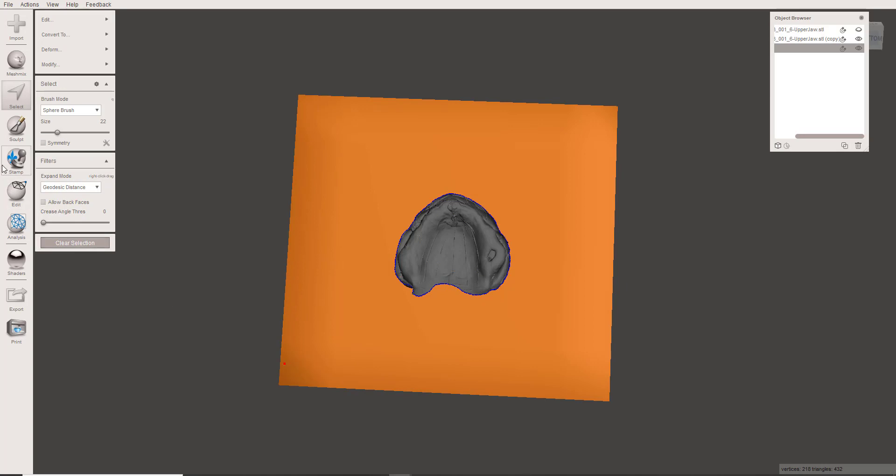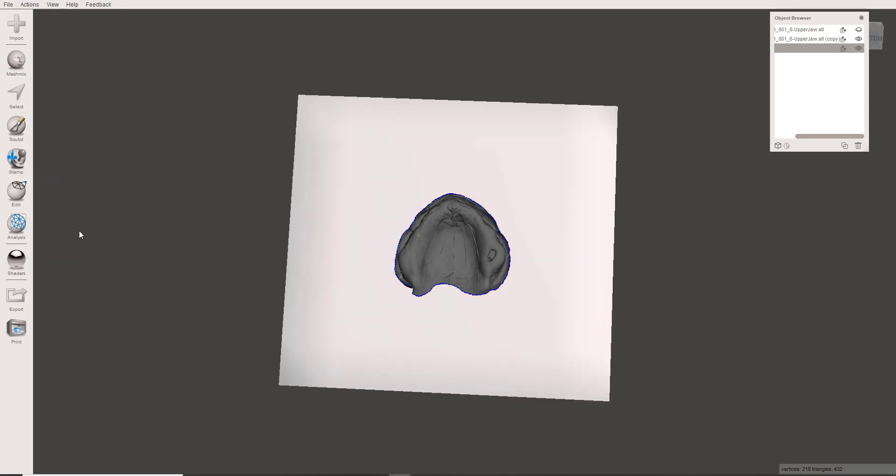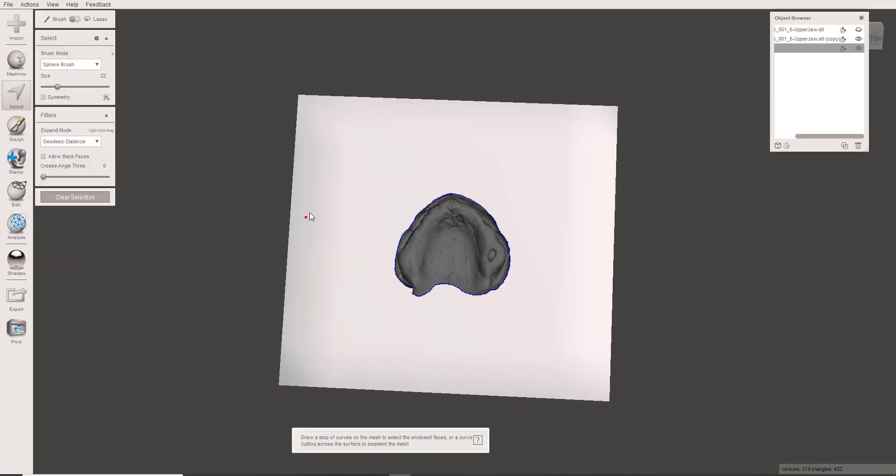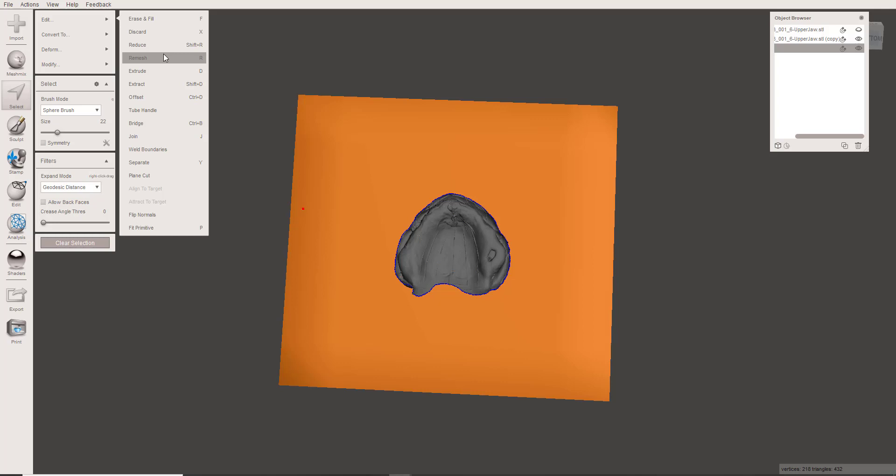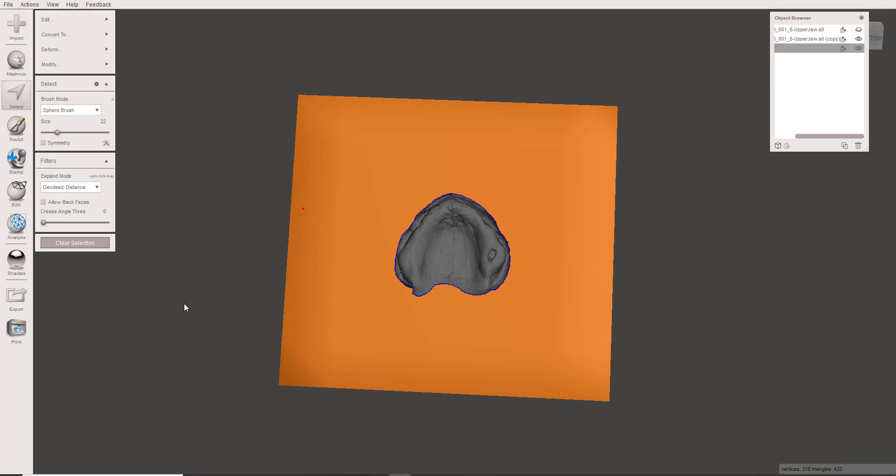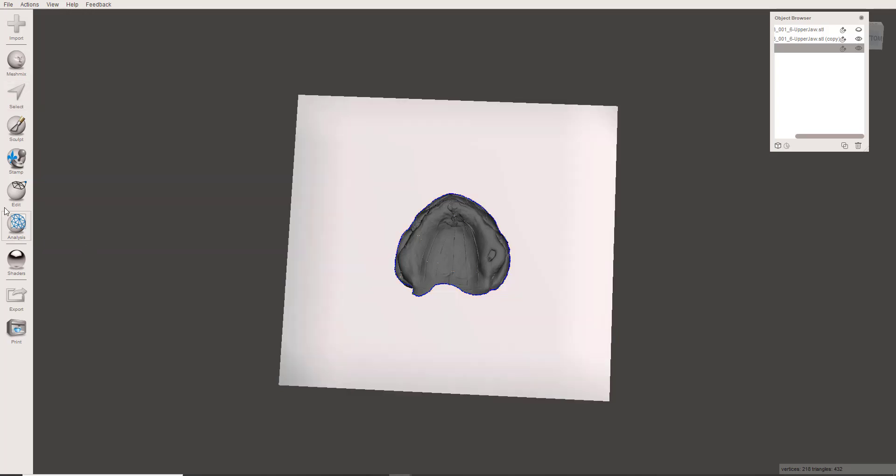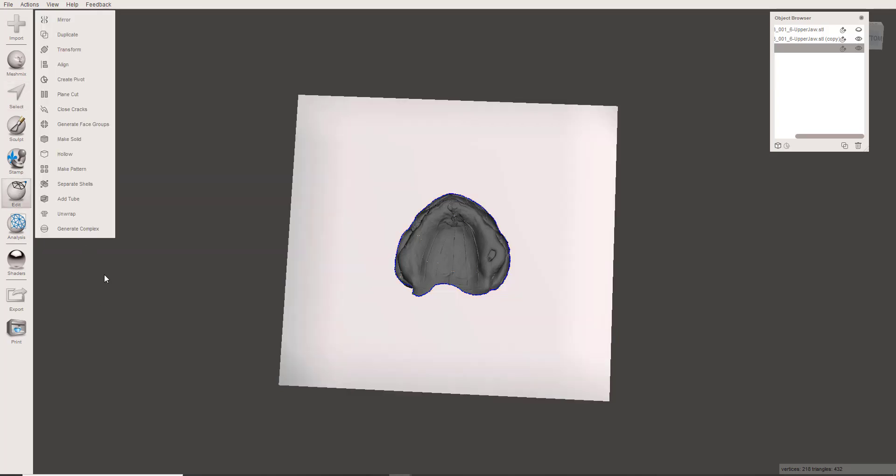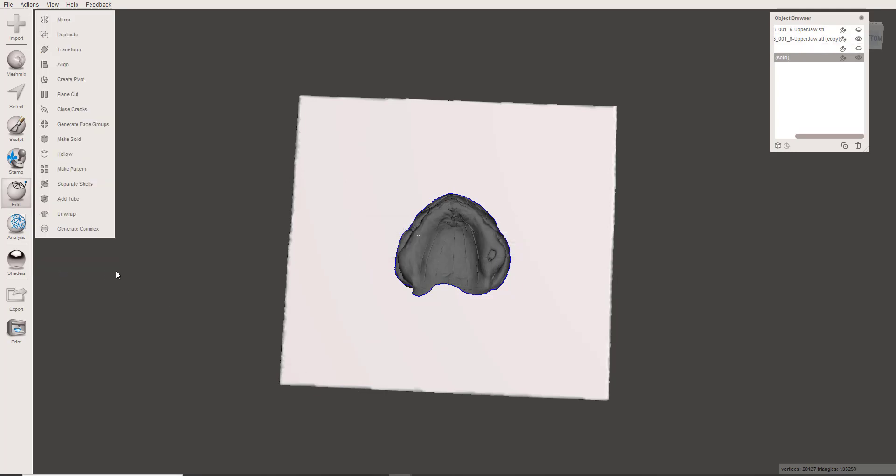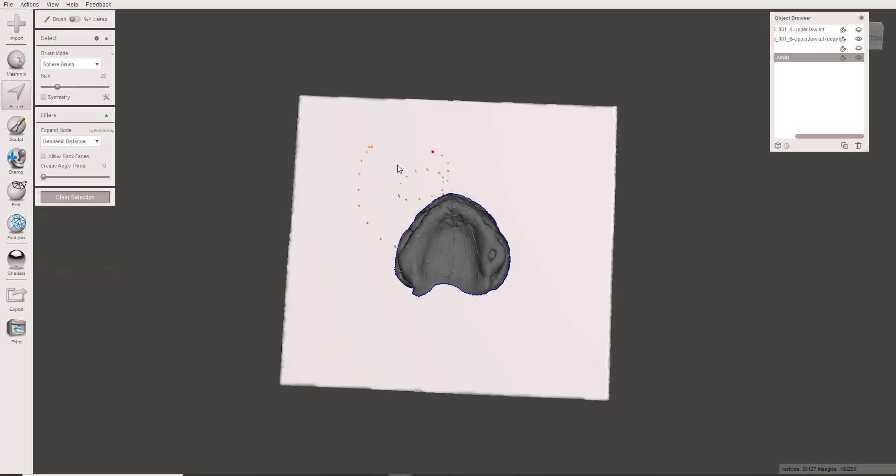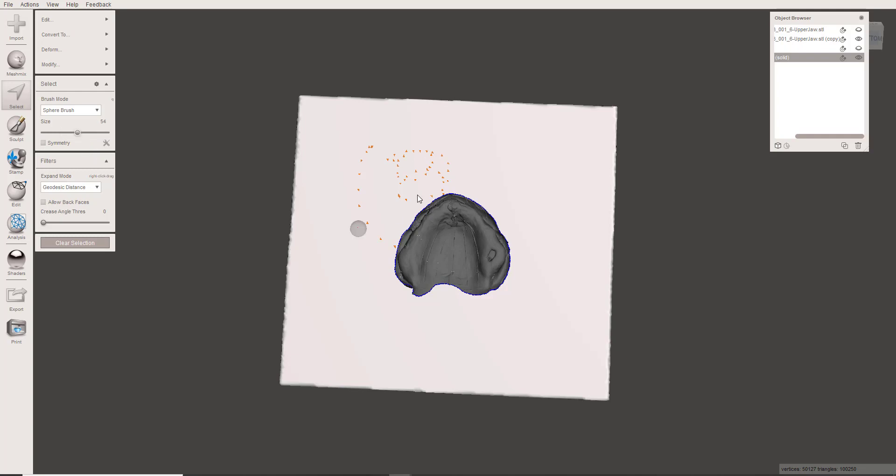You've got a couple of ways. You could select all this and go to Edit and Remesh. My preferred method is just to go up here to Make Solid, and in the process of making solid, it's going to also make a more dense mesh. Notice here when I do this now.